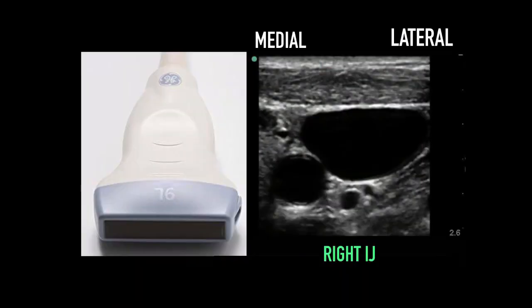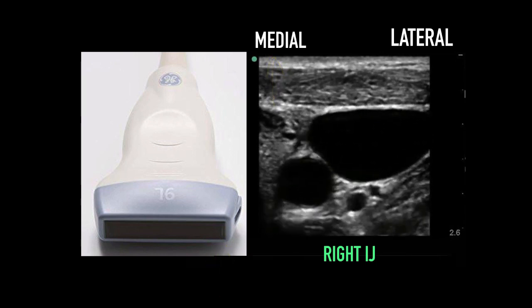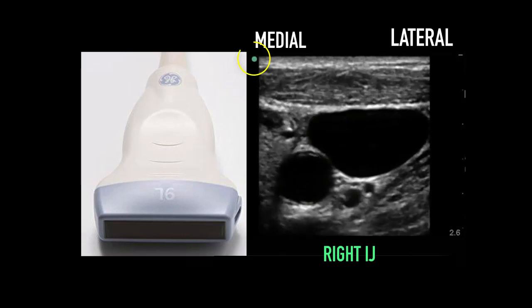Understand the probe has a specific orientation. In this case, the marker is often proprietary. It can be a notch. It also can be a light. Many people will establish the side of the probe by tapping the end of the probe and examining the screen simultaneously. The screen also has an orientation, which has a screen marker here.